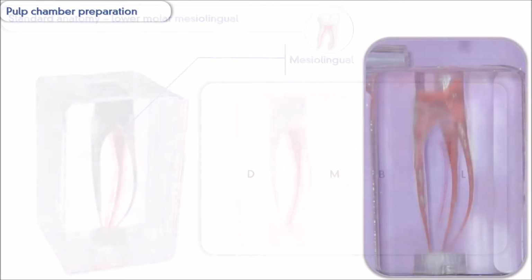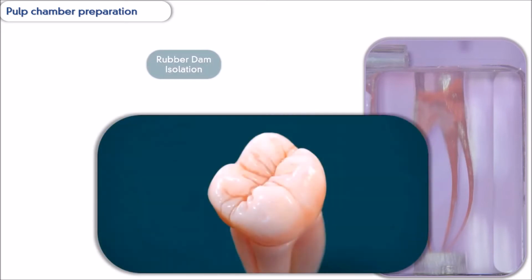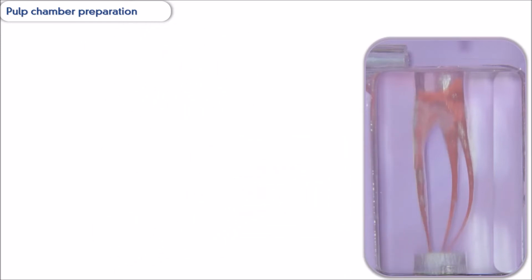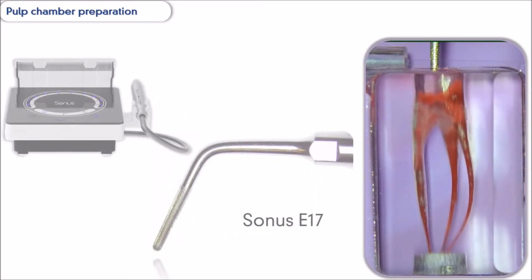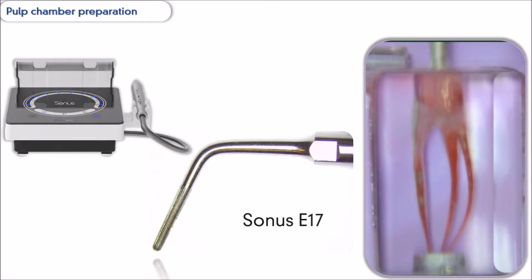Before starting the instrumentation sequence itself, some important procedures must be highlighted. It is always good to remember that rubber dam absolute isolation is mandatory in endodontics. First, we will clean the pulp chamber and prepare the canal's entrance using the Sonus E17 conical-shaped ultrasonic tip, with constant irrigation, gently touching the access preparation sidewalls.